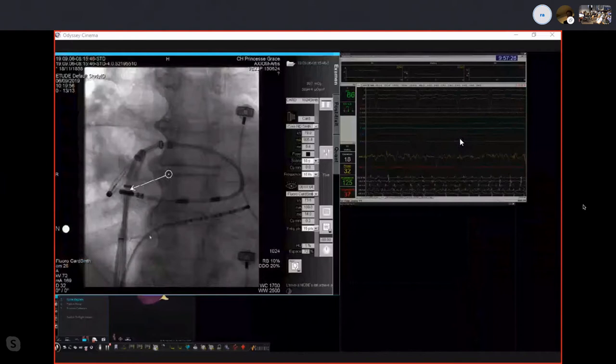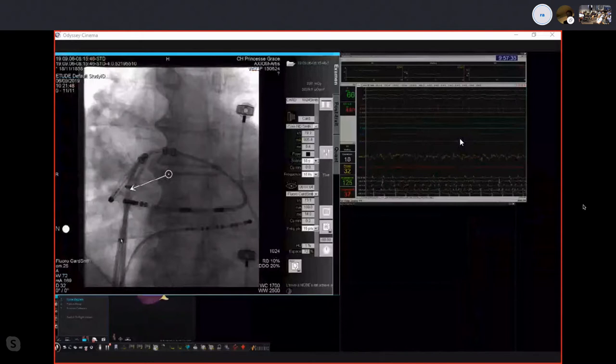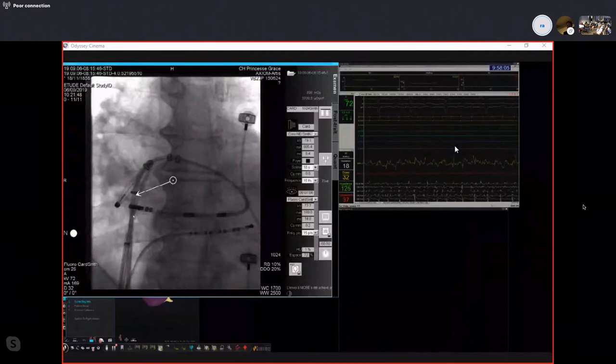Here you go. So you see that we put a decapolar catheter into the coronary sinus. We have a first sheath which allowed us to put transseptally the Orion catheter, which is a basket catheter with 64 electrodes, which is now closed because it's in the right inferior pulmonary vein. We also have the robotic sheath, the VIZIGO deflectable sheath, and the ablation catheter, which is the Celsius RMT Thermocool catheter. That's an irrigated 4 millimeter tip catheter with magnets for magnetic navigation.